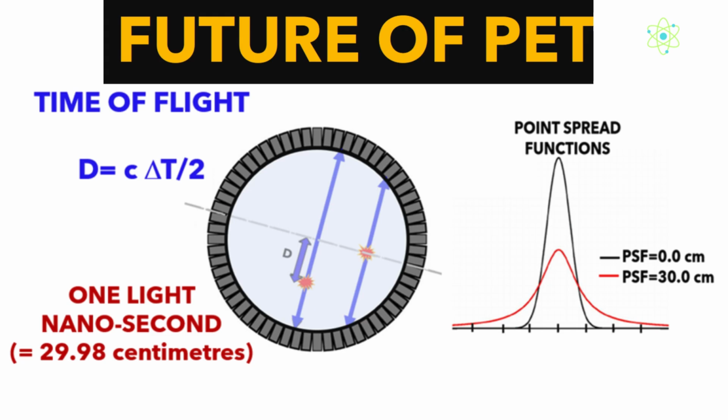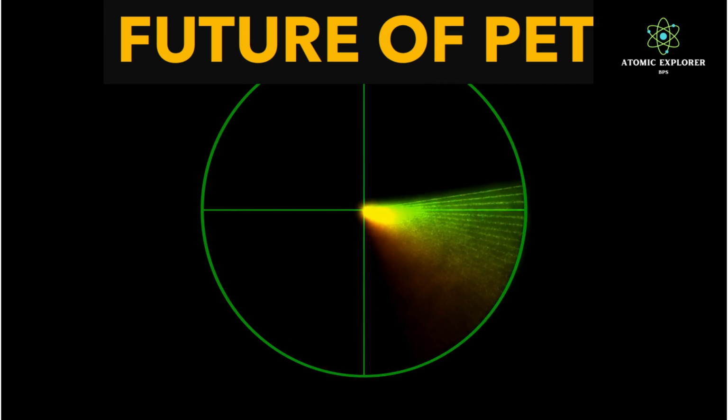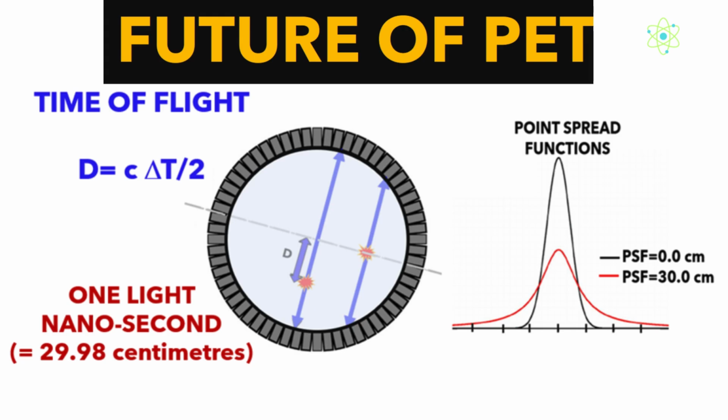Time-of-flight PET scanners are advanced medical imaging tools that use fast gamma ray detectors and sophisticated data processing. They measure the precise time it takes for the gamma rays from the radioactive tracer to reach the detectors. This timing information creates clearer, more accurate images of the body's internal structures. The enhanced image quality improves lesion detection and allows for more accurate measurement of tracer uptake, which is crucial for diagnosing and treating cancer.